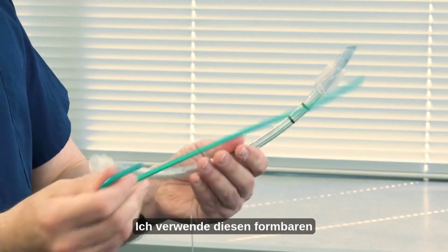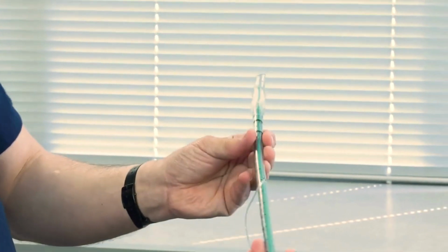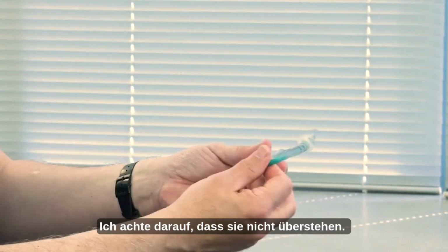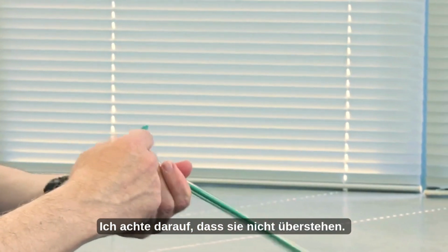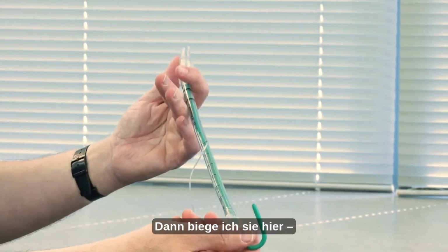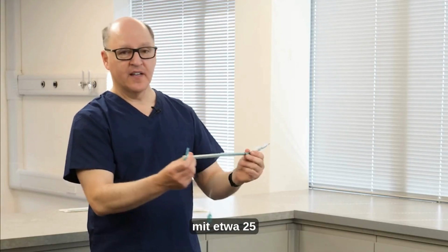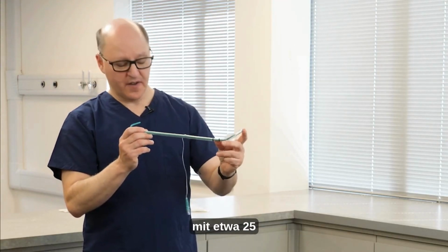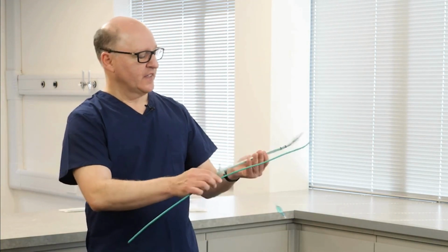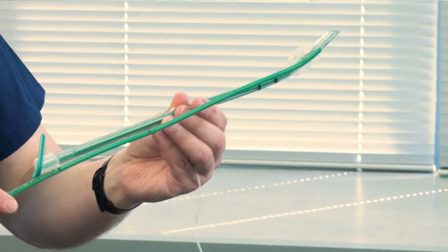So I use these malleable stylets. I insert it to the point where it goes to the distal cuff, so I make sure it has that stop there. I don't want it to extend out. I give it a bend here, and I call this straight to cuff stylet shaping, and I'm aiming for about 25 to 35 degrees, basically similar to the distal deflection of a Bougie.